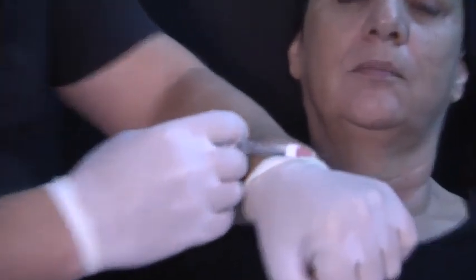But let me show you what I'm going to do here. So this is Restylane Lift. What I'm going to do on my hand is this bolus, as I would do on the face of the patient. Look at this. If I inject a bolus with a needle, this is only 0.1. Imagine if I inject more. Look at that projection. Now, if I do another one here, that's another 0.1, and I'm going to use more product than this.